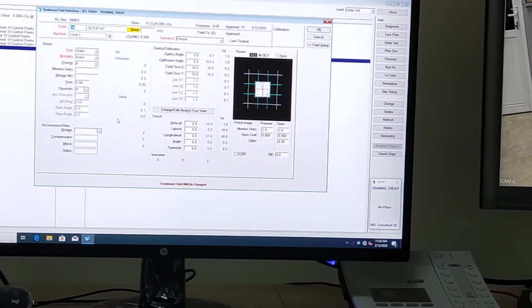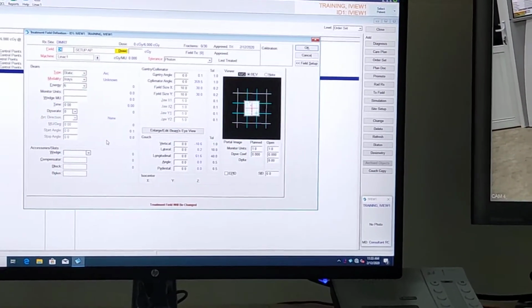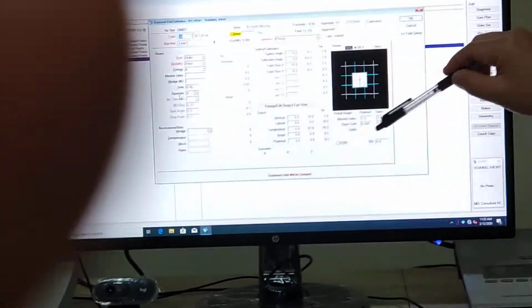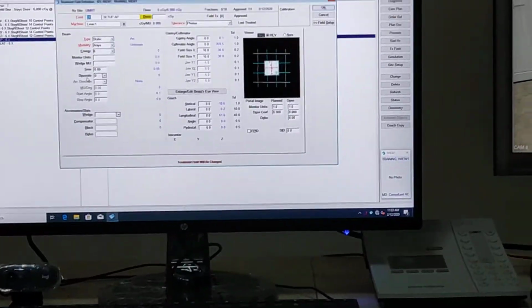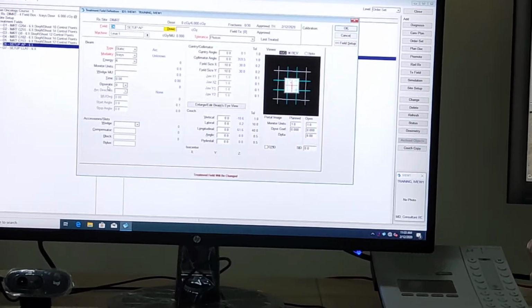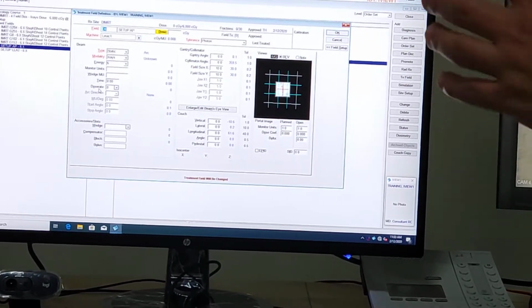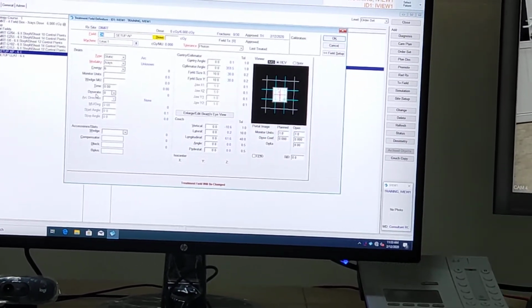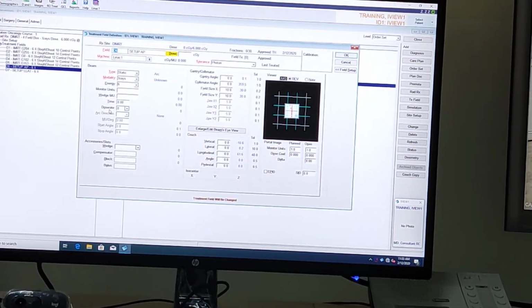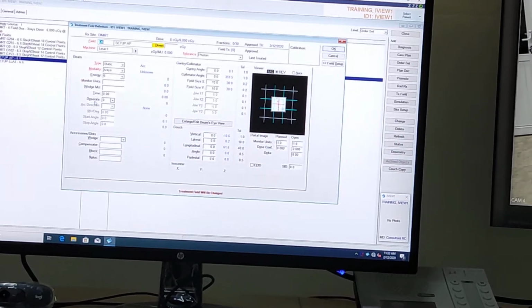Training. So remember that monitor unit adds dose to patient. So we avoid an open field. What does it mean? We have double exposure. You know double exposure. We expose the plan field and then we expose a bigger one called open field so that we can have two shades of gray. The plan field gets darker gray.